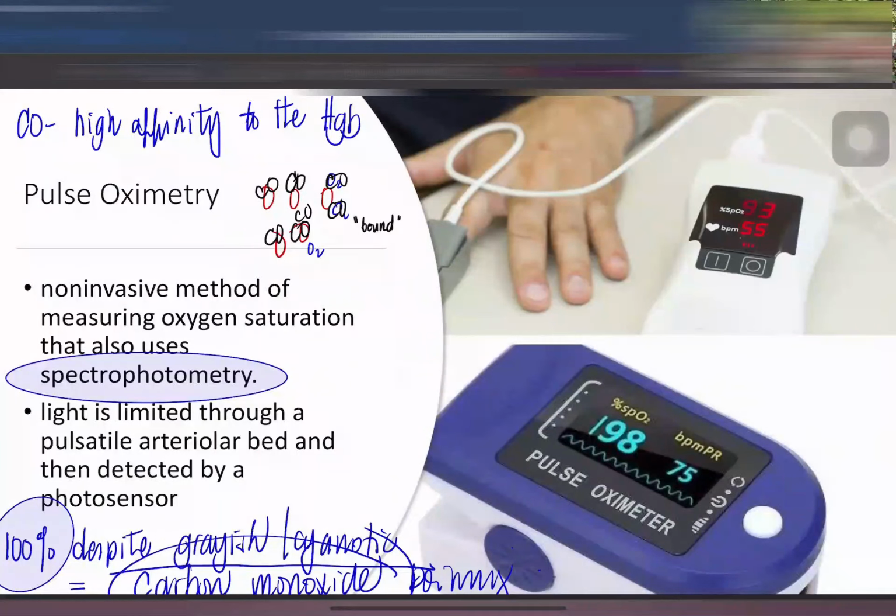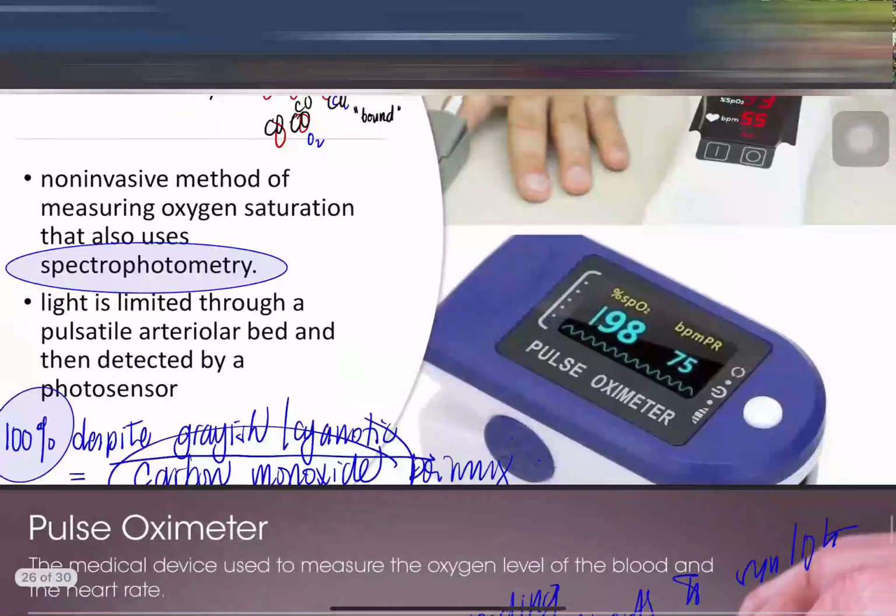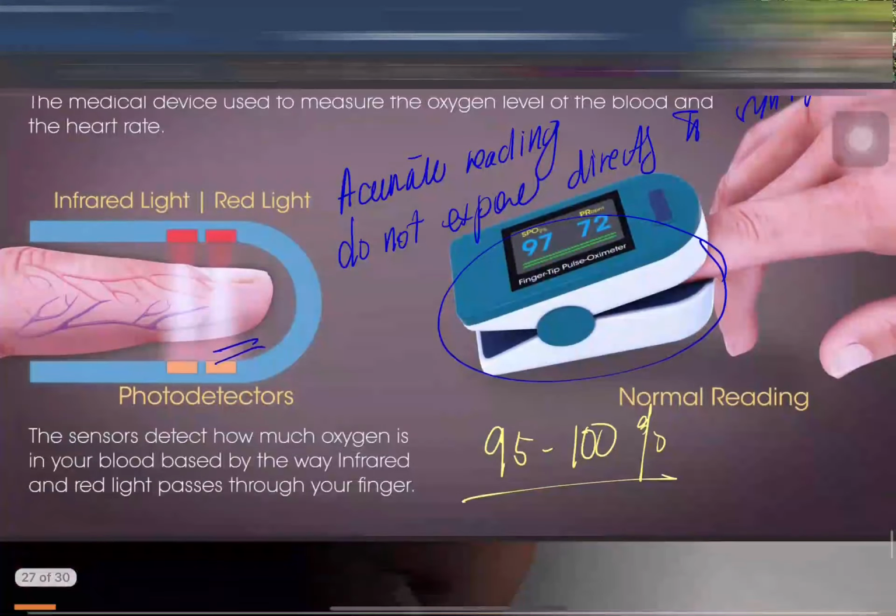Because maybe the patient is cyanotic, say, turning dark. Then when you check the pulse ox, sir, it's 100%, you're okay, sir. Then the patient complains, nurse, I have difficulty breathing. When you check the pulse ox, sir, 99%, you're okay. Sir, don't be dramatic, right? It turns out you, the nurse, were the one who was foolish. So class, be careful. Again, you do not treat the machine, you treat the patient. That's the point that I would like to repeatedly emphasize when we are dealing with technologies.